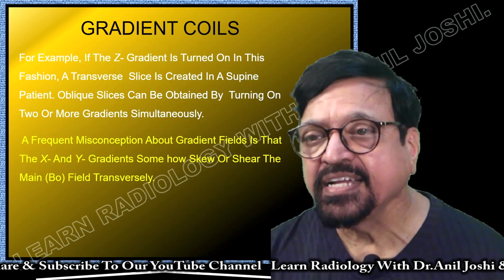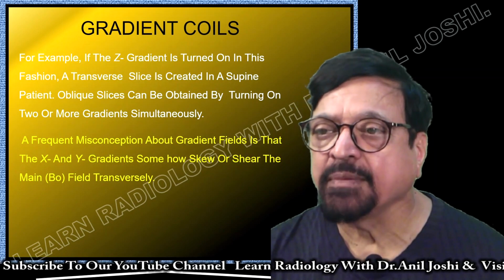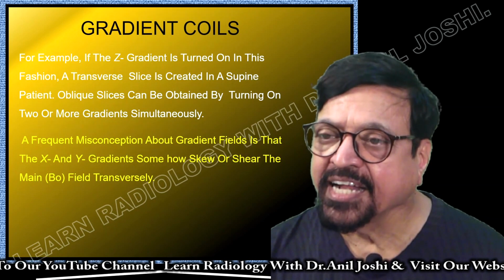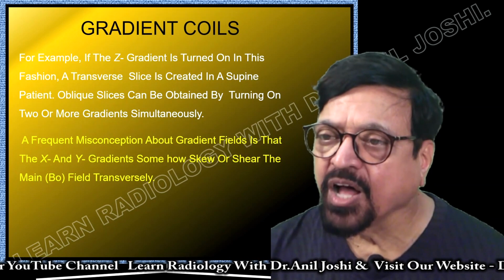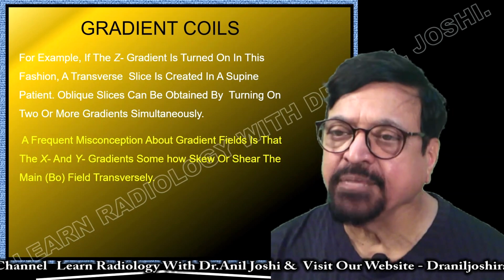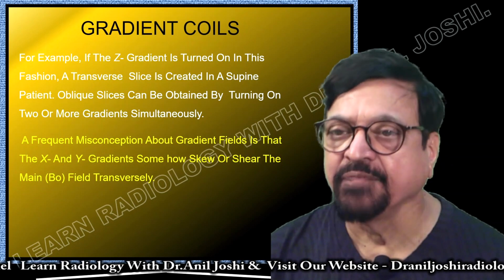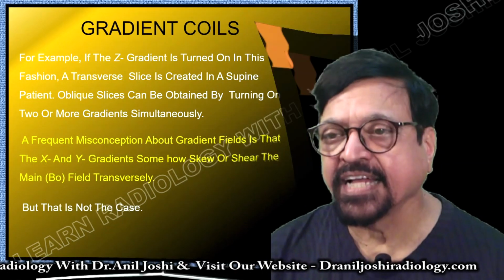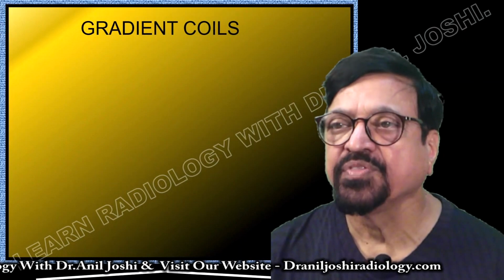A frequent misconception about the gradient field is that the X and Y gradients somehow skew or shear the main B0 field transversely. This is a frequent misconception, but it is not true. As I said, it is a misconception.